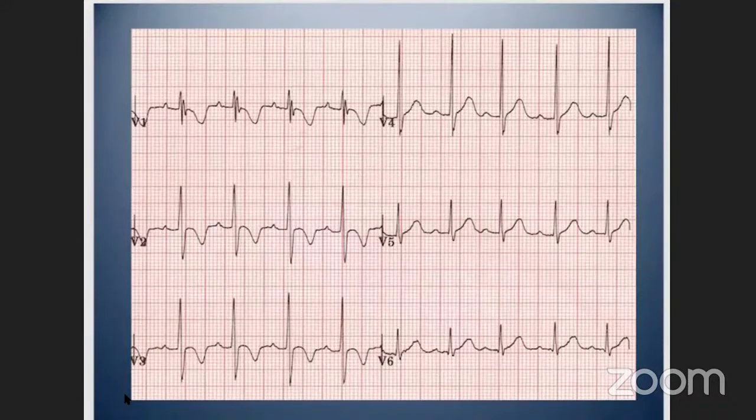However, this is an 8-year-old male, and ECGs in children are always a different consideration. And so this is just persistent juvenile T waves in the pediatric patient, because we know that children, when they're born, they have equal right ventricular and left ventricular mass. And so their ECG shows more of an equivalent conducting pattern. But then as they grow up, the right ventricle diminishes in relative size to the left ventricle. And so this strong right-sided pattern that we see here is just persistent juvenile T waves. So this is a normal ECG in a child.